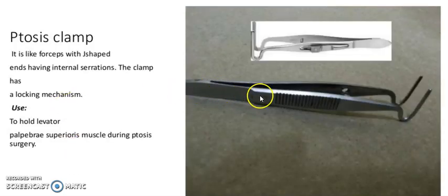It is a ptosis clamp. It has a J-shape and internal serrations. The clamp has a locking mechanism and is used to hold the levator palpebrae superioris muscle during ptosis surgery.